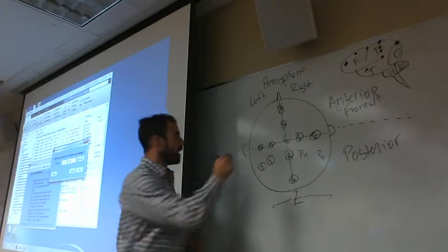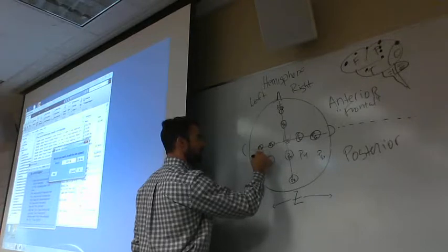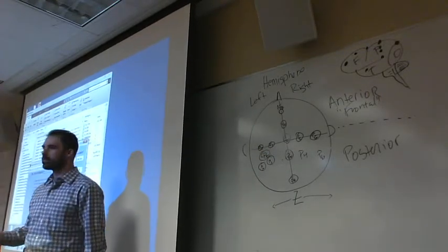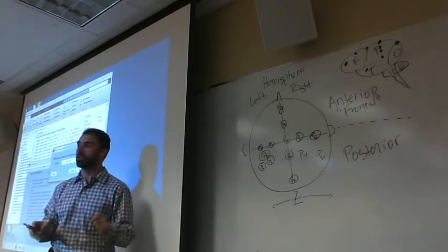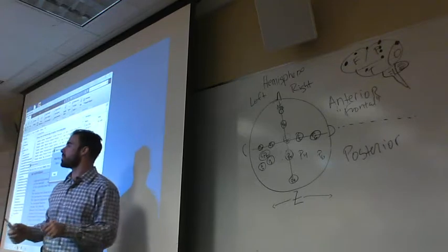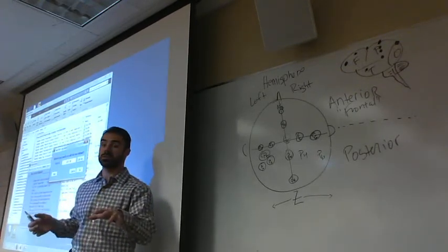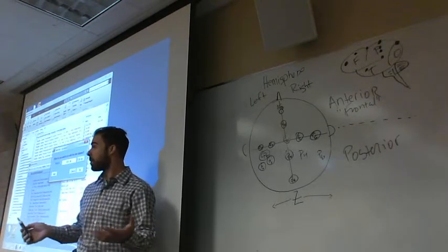You could also have central parietal, CP5. It's intuitive when you think about it, and it's designed that way. And that's what I'm trying to share, the intuitive organization of this. Because you're going to see plots from all these electrode sites, and it's going to be important to know what it is referring to. Where in the head is this happening?